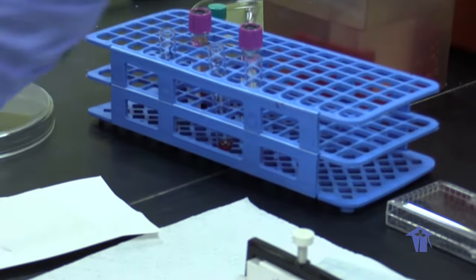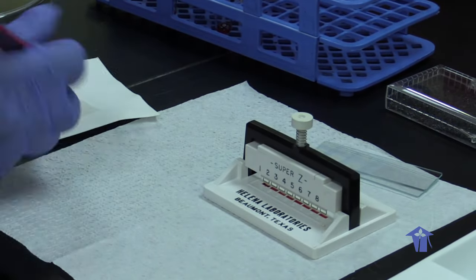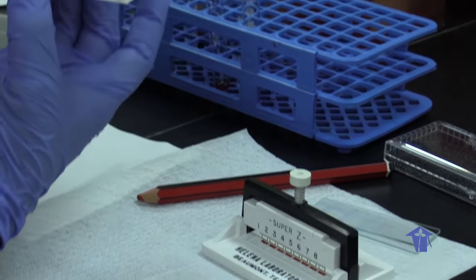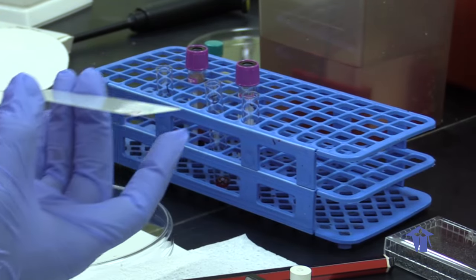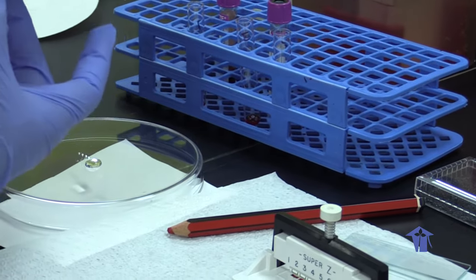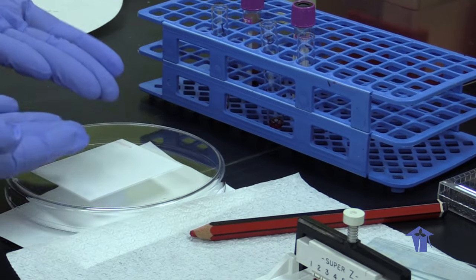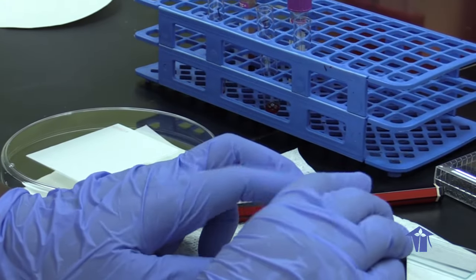So we're going to label this plate, plate 1, using a china pencil. Then on the glossy side, we're going to put a drop of distilled water. This is for the plate not to stick to the surface, and we're going to flip it over to get our cellulose side up. Now we're going to apply the sample.